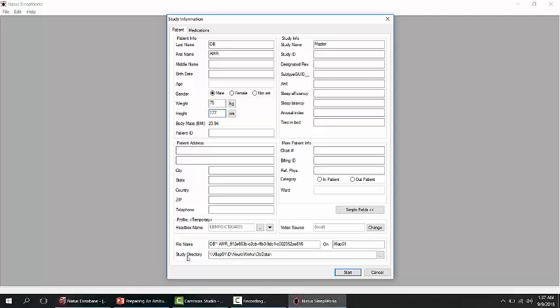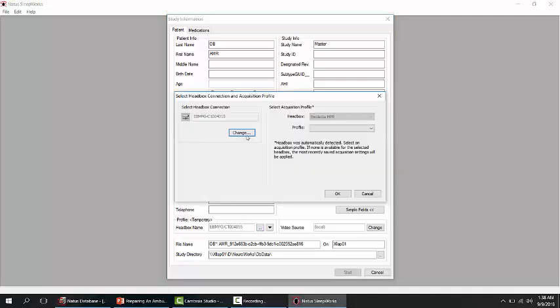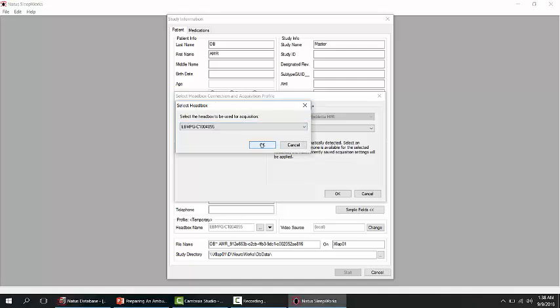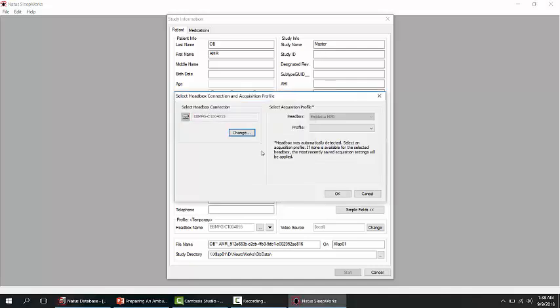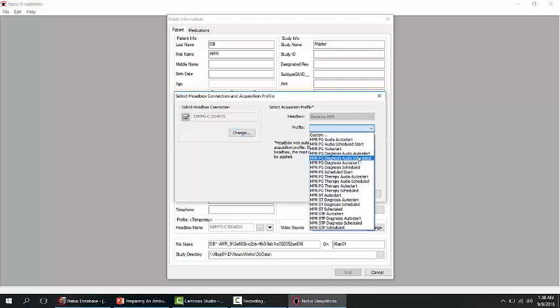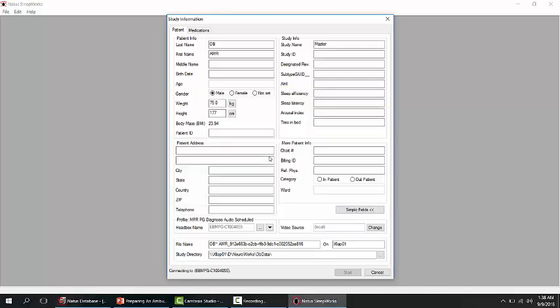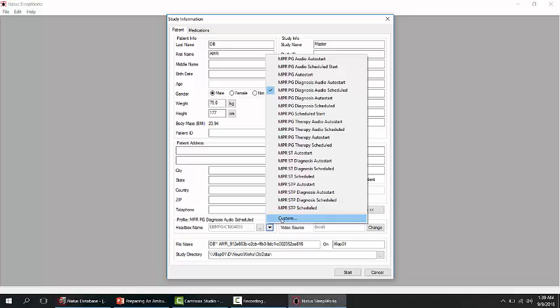From the Headbox Name option, search for the MPR device and select it. You can also select the acquisition profile, then click OK. If you want to edit the default profile, from the drop-down list next to the Headbox Name, choose Custom.